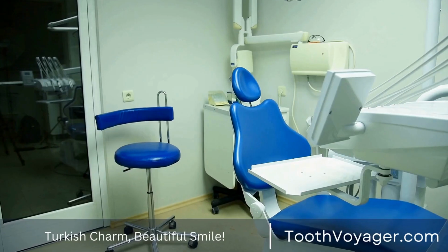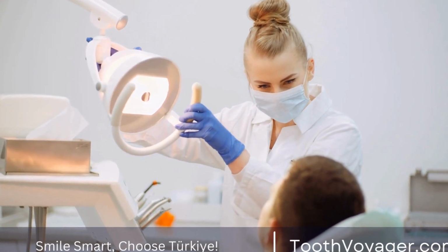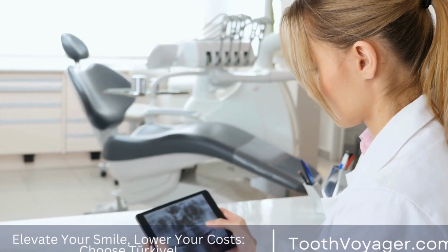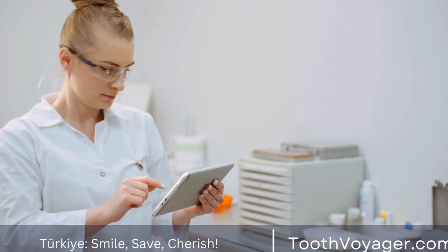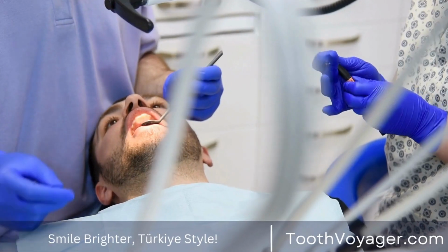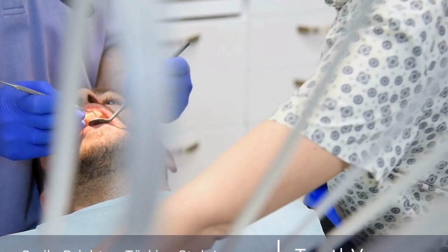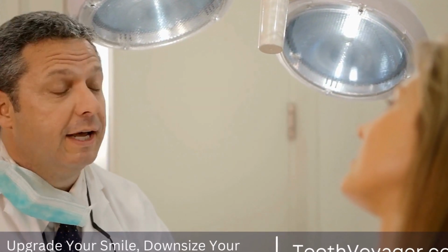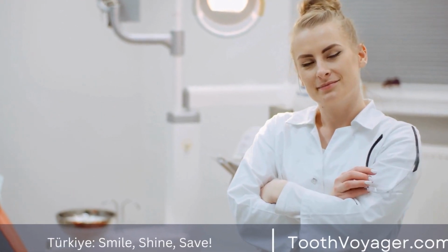1. Traditional implants. The traditional dental implant is the most commonly used kind of implant used by dentists. It comprises an implant made of titanium, which is surgically placed in the jawbone. There, it is used as a tooth root for the damaged tooth. When the implant is fused with bone, the crown is connected to the end of the screw to complete the repair. Traditional implants are well known for their stability and strength. They are a good choice for replacement of one or several missing teeth. They also can help to prevent tooth loss as well as maintain the overall structure of the jaw.